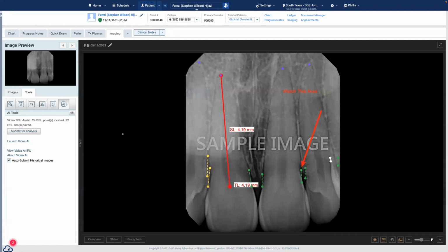It's good for communication. It has a lot of benefits. Sure, some people can abuse it and use it for different purposes when it comes to payment, but it is a great technology, and it enhances our skills as a dentist. So it's going to be here, and more and more offices are going to be using it.